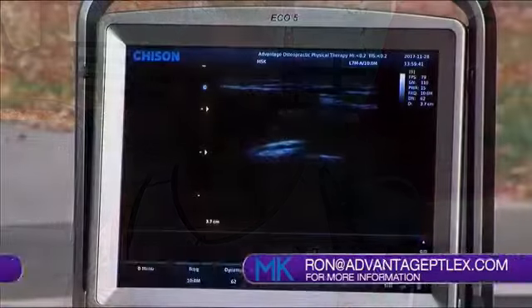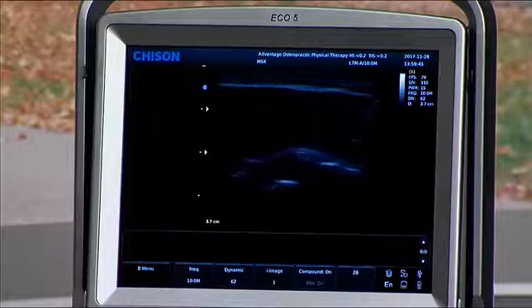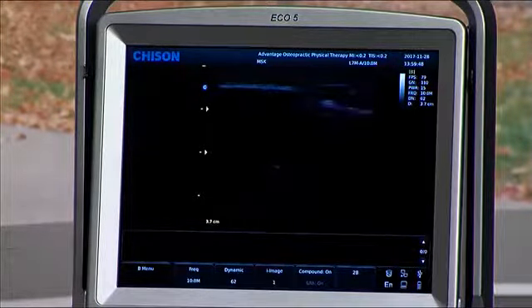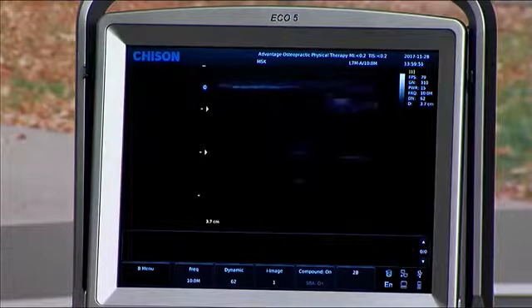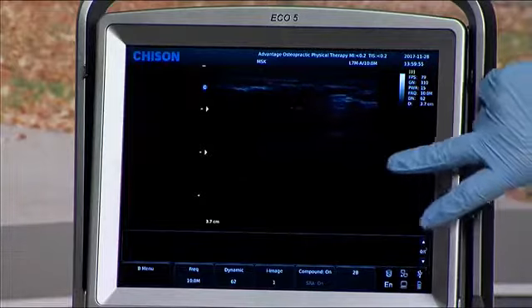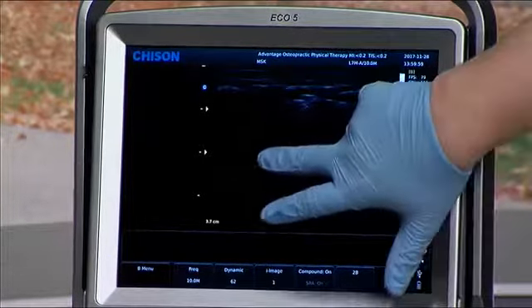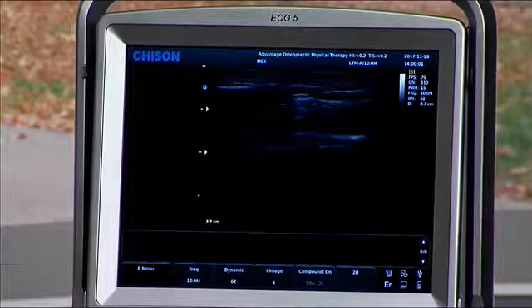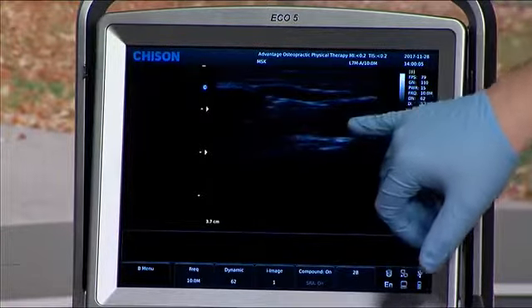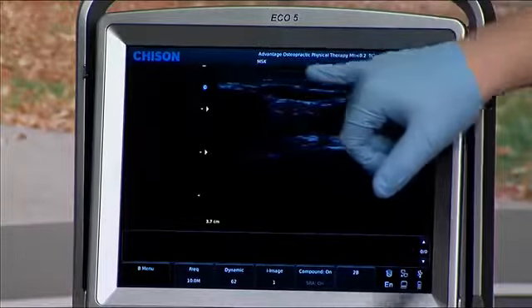What we're looking at on the screen here now, if you just look over to the monitor behind the cameras, what am I looking at? To everyone at home, explain that. Right now we're looking at his shoulder, if you don't mind to put your hand up like this. And what you should see, it's hard to see through the cameras, but on this we see this bright line through here is the bony structure. Oh, wow. And then as we see, we have muscle overlaying on top of that, and then some subcutaneous tissue, and then the skin there.